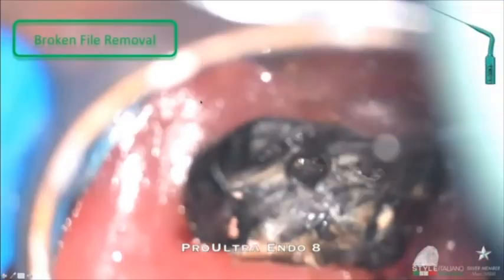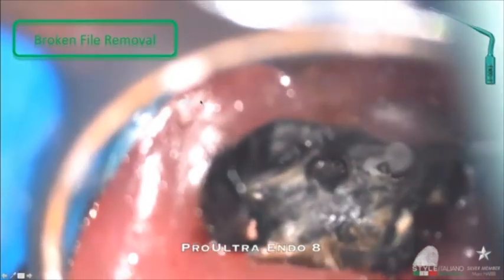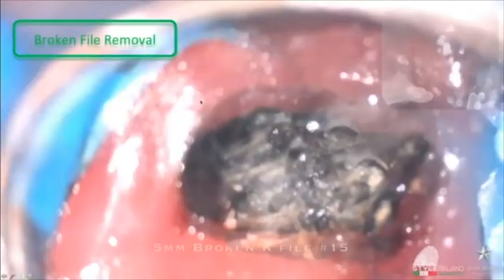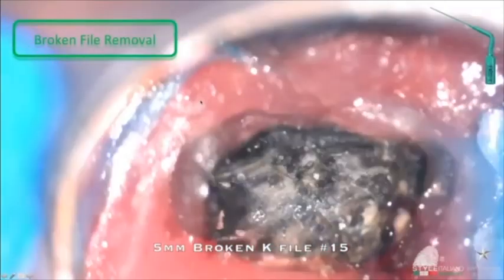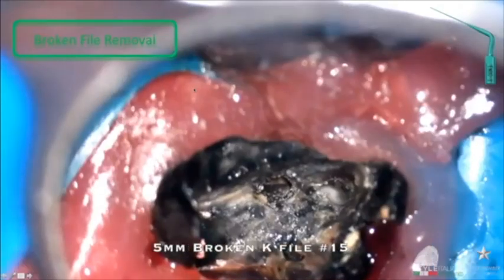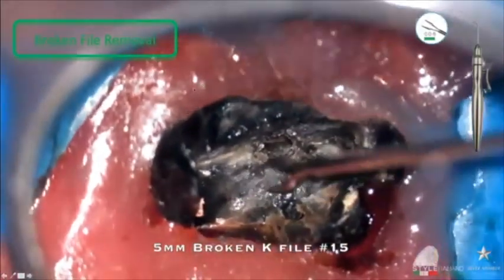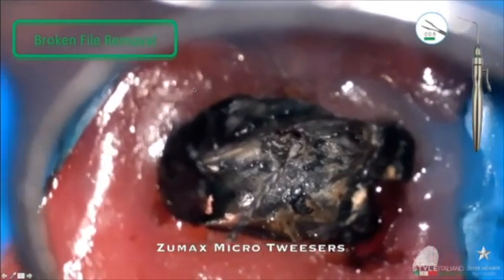So I'm seeing it's loose, it's not at all squeezed or blocked in the canal. So here it's more coronal than before. I'm trying to grab it with the Zomax micro tweezer, and it's out.